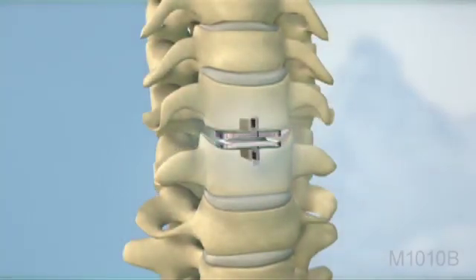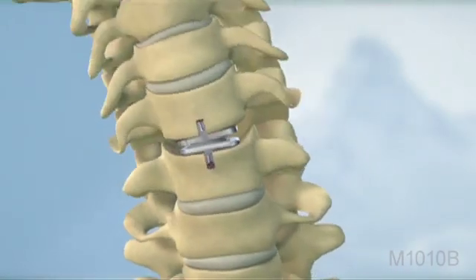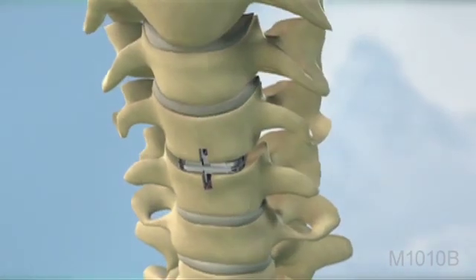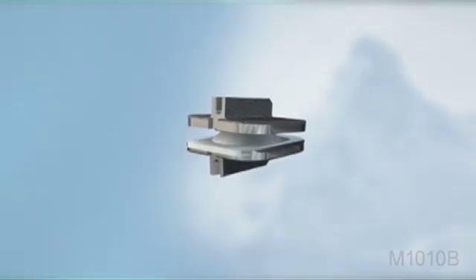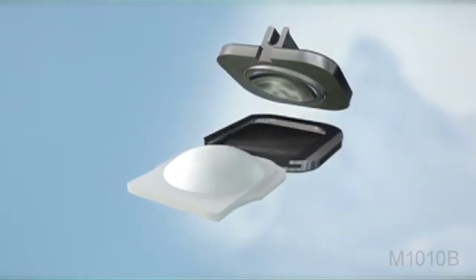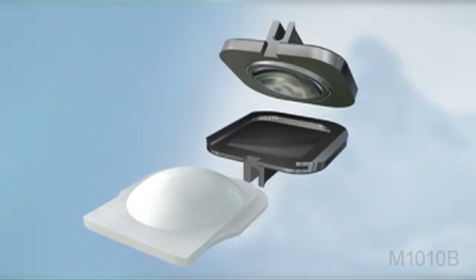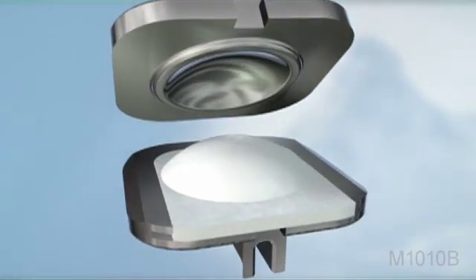The Prodisc C is a ball and socket implant that is composed of two cobalt chrome alloy end plates and a polyethylene insert. The polyethylene insert is affixed to the bottom end plate, forming the ball, and a polished dome in the top end plate forms the socket. The implant components work together with the surrounding spinal structures to provide stability and function.